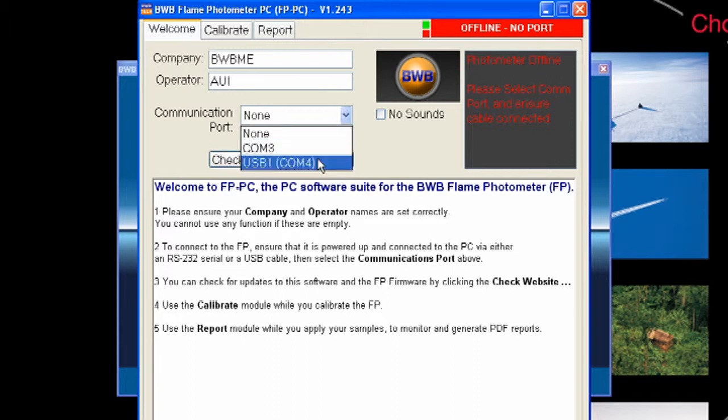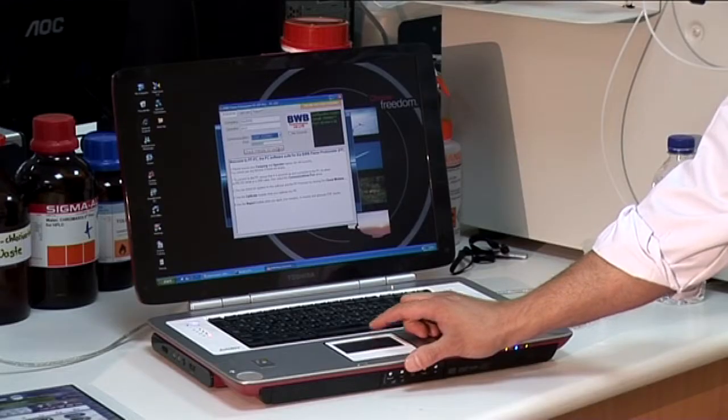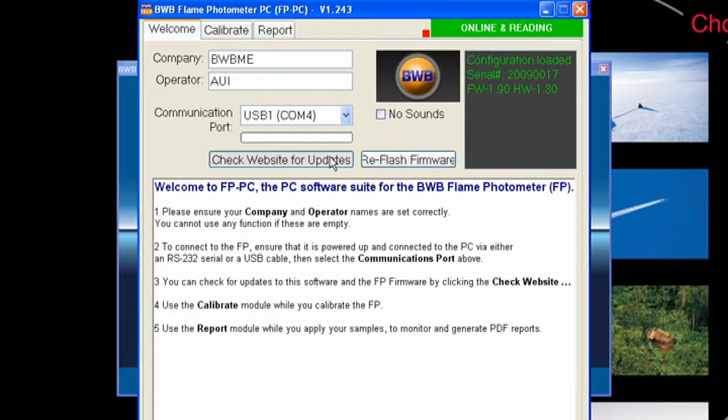Set the COM port so the BWB XP can communicate with your computer. The FPPC software also includes free software and firmware updates. Simply connect your PC to the internet and press web update.